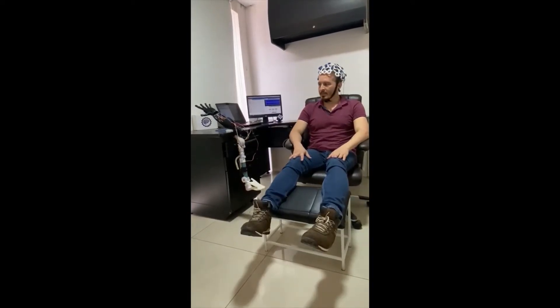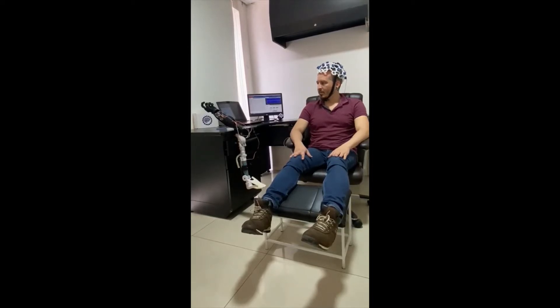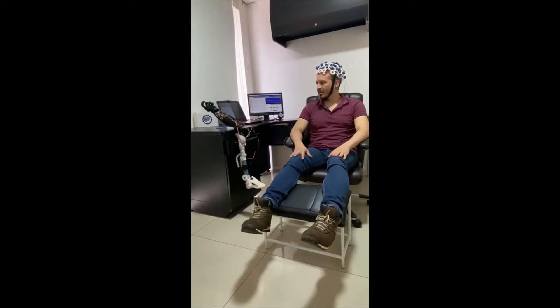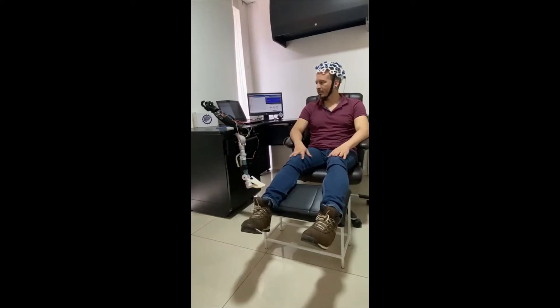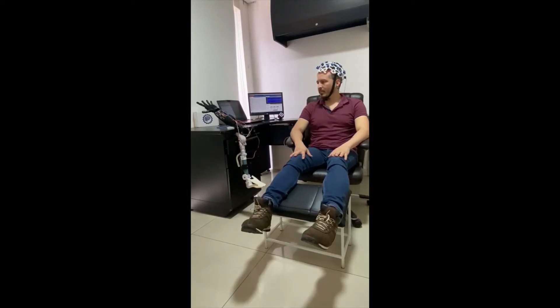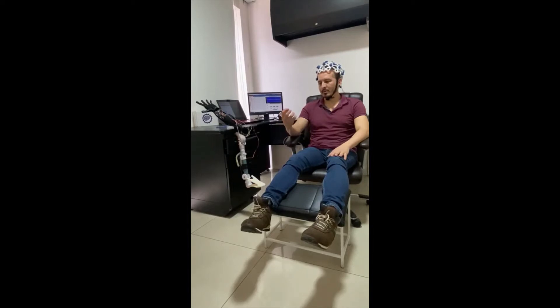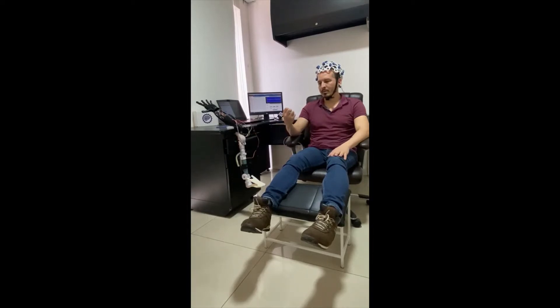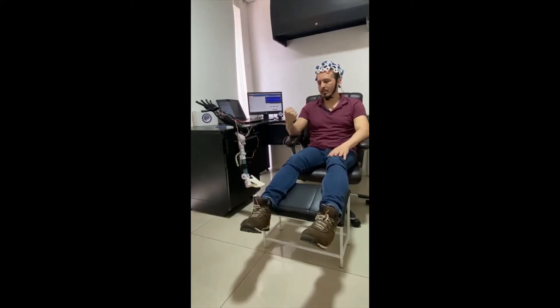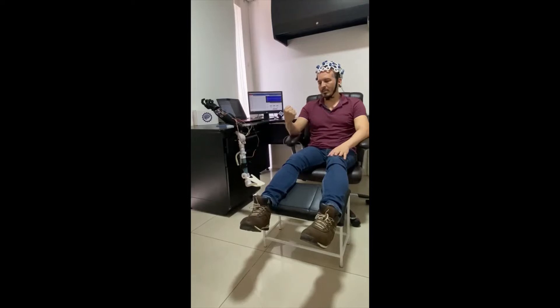In this demonstration, we will do the prosthetic arm control. I can keep the hand closed, and I can also open the hand. I can also see my own hand closing to control the prosthetic arm. Closing the hand now — likewise, I can open it.